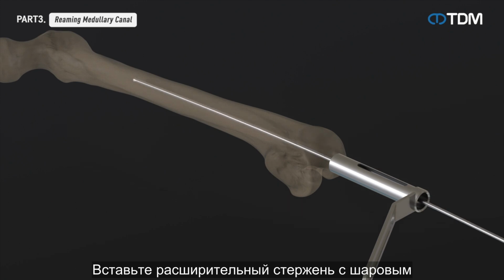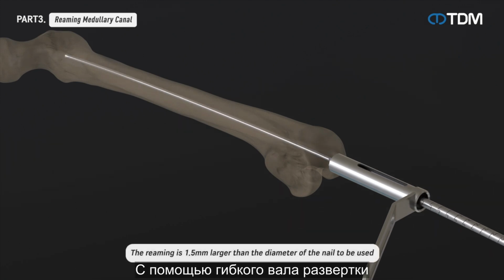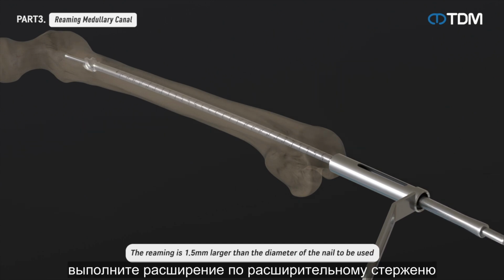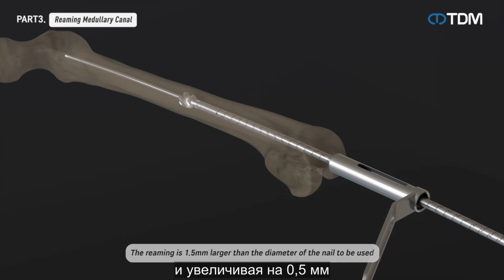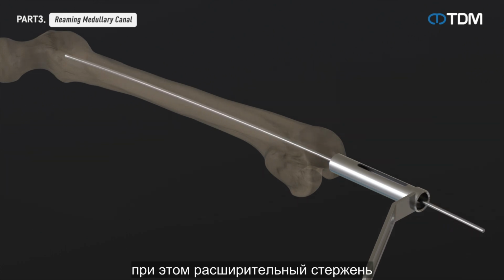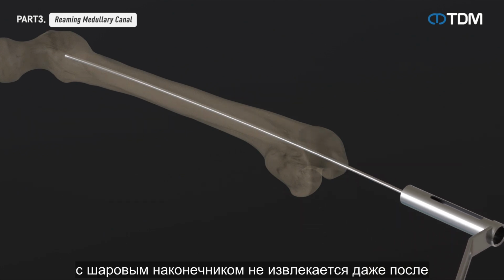Insert the reaming rod with the ball tip to the desired depth. Using a flexible reamer shaft, reaming is carried out along the reaming rod to the desired size by starting with an 8.0 mm reamer head and increasing by 0.5 mm, and the reaming rod with the ball tip is not removed even after reaming is completed.